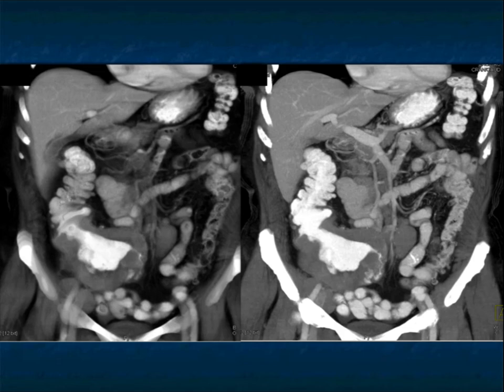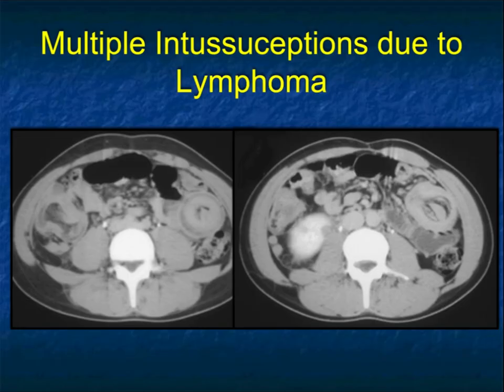This is a good example of where positive contrast works very nicely. You see the infiltration of the wall of the bowel, the lumen, and the ulceration present. One of the things with lymphoma is it can cause intussusceptions. Essentially every mass in the small bowel can intussuscept — be it benign like a leiomyoma or lipoma, or metastasis, adenocarcinoma, or carcinoid. When you have multiple intussusceptions, then you're thinking about lymphoma.